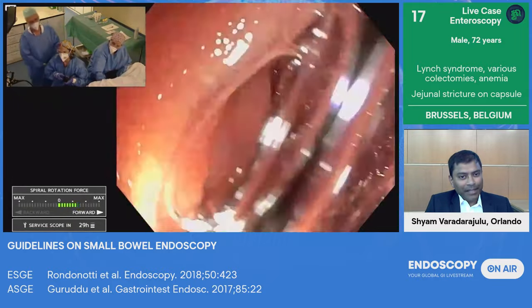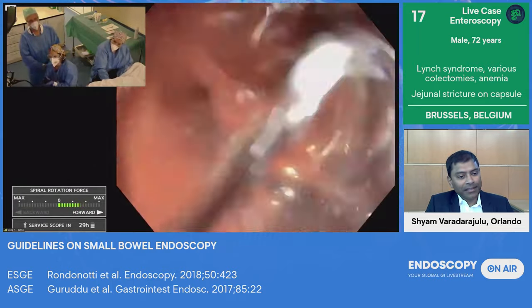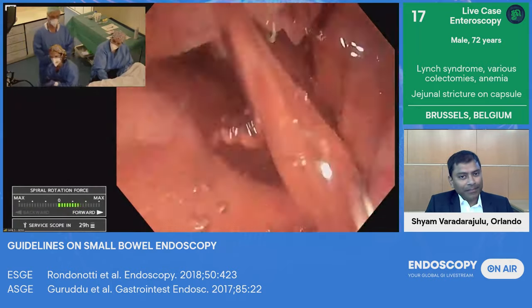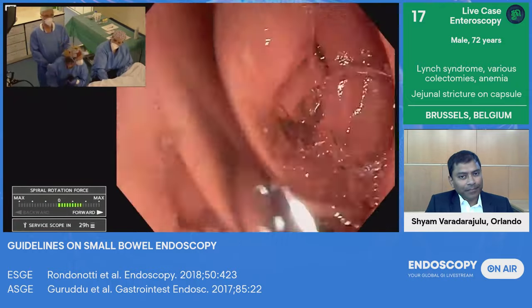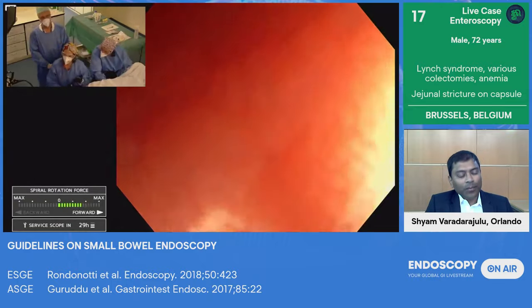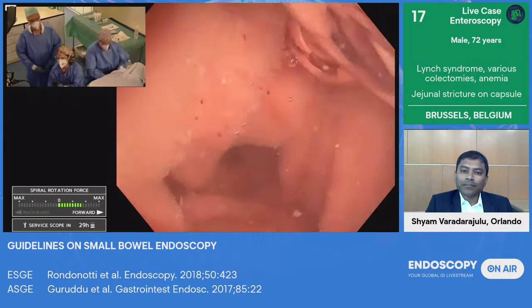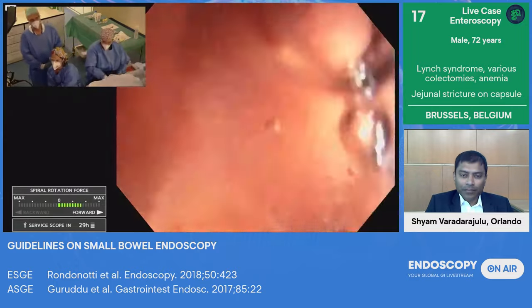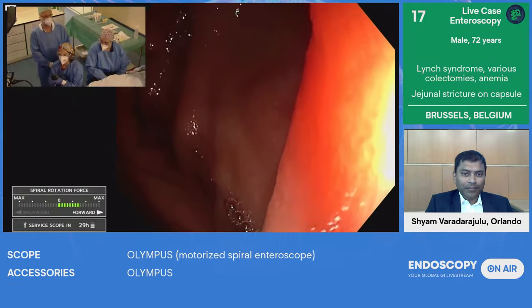Okay, and then obviously you will do some biopsies. And then of course, as I told you at the beginning, the purpose of this exam is not to treat the lesion, but to take biopsies. Yeah, right. And also to inject India ink to help the surgeon to localize the lesion if the patient has to be operated on.